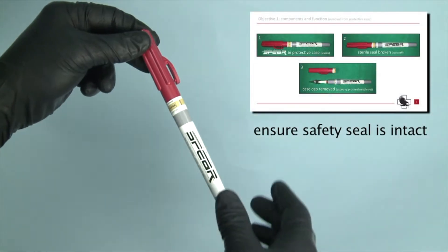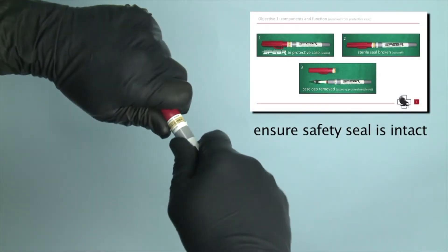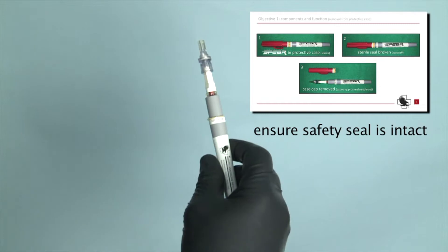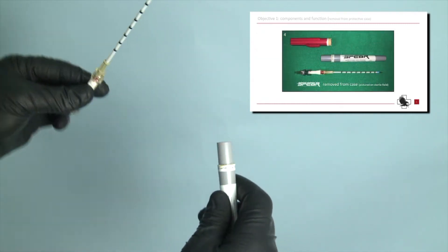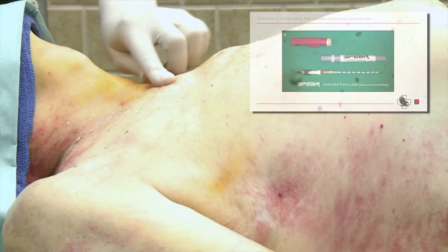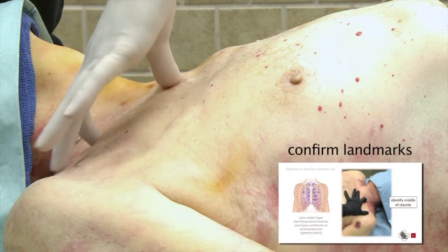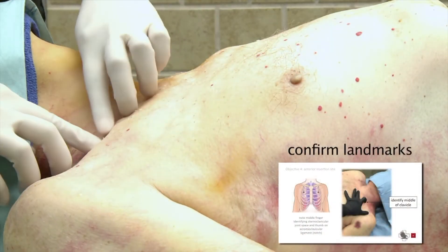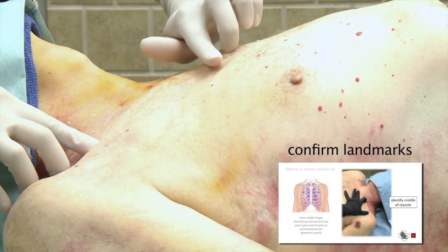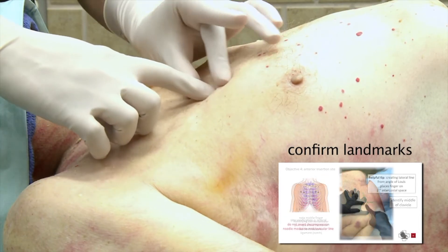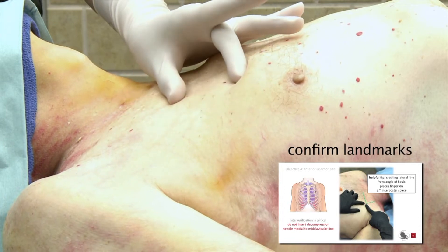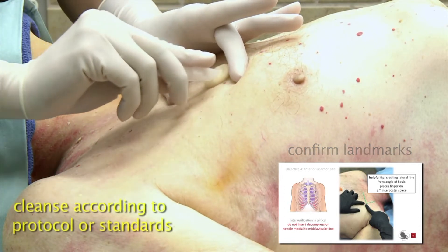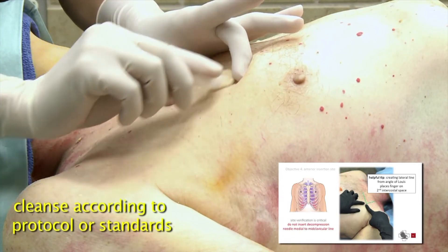Grasp case and ensure safety seal. Twist off cap and remove SPEAR. Confirm landmarks: second intercostal space, mid-clavicular line.